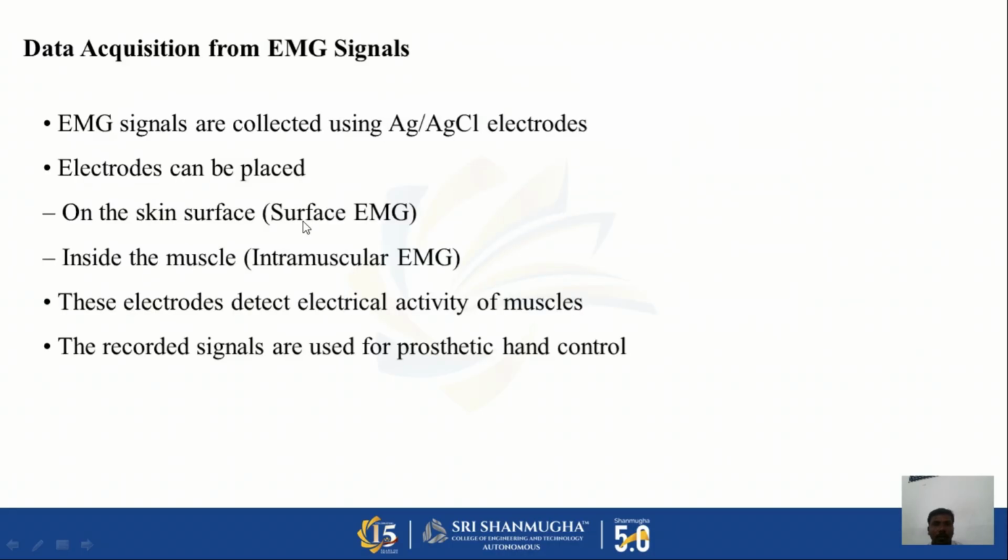So next slide we are going to see data acquisition from EMG signals. The first step in prosthetic control is EMG signal acquisition.